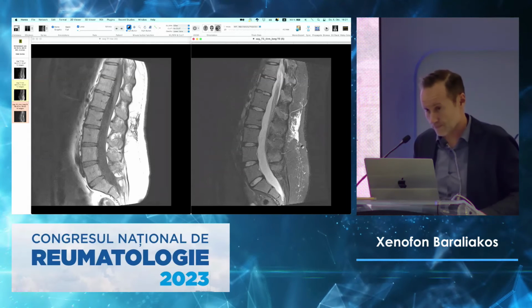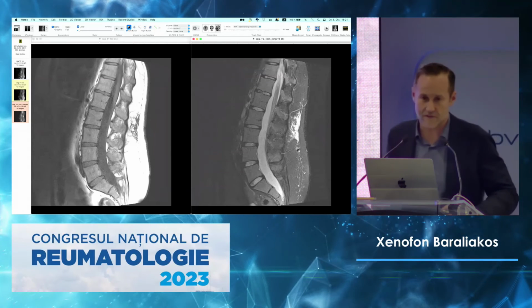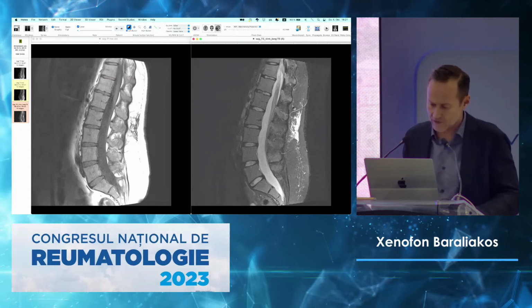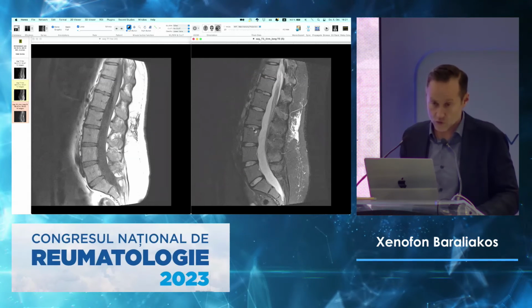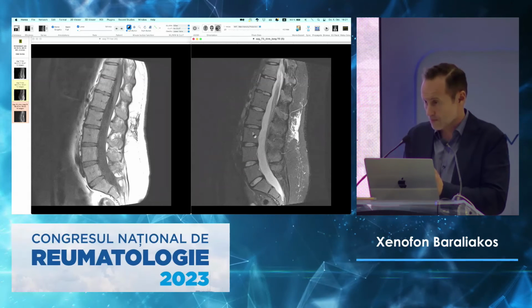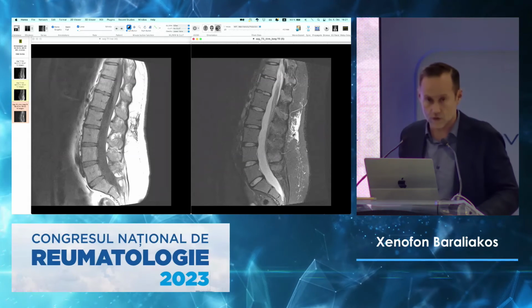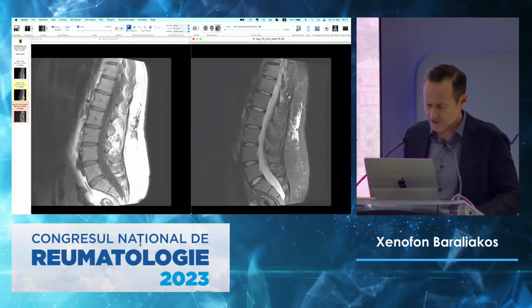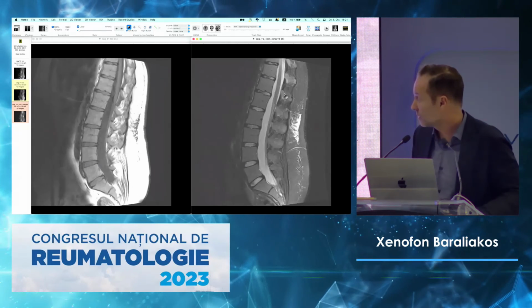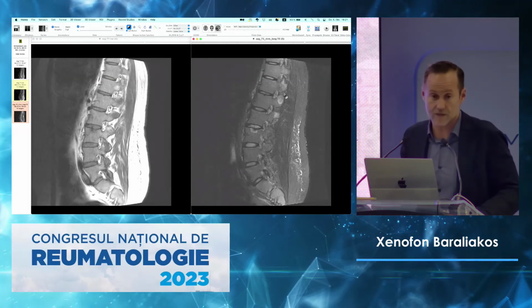The other thing that you also need to pay attention to is this one. That's normal. This is happening to almost everyone, and you lie on the bench of the MRI for a longer time, and here where you have the lordosis, the vessels come together. And when you go walk around, this will go away. So that's totally normal. So her problem is the facet joints, indeed. Here you see that relatively clearly, the other side as well. And that patient needs clearly treatment.